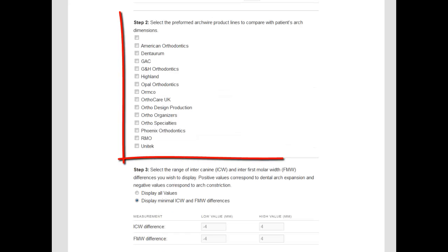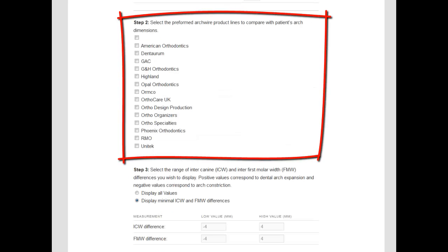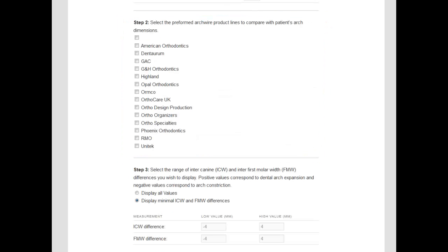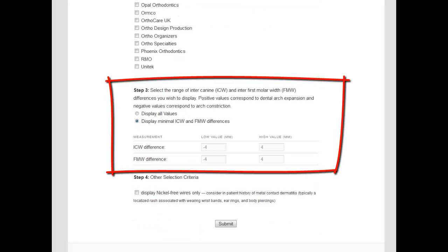The second section is for vendor selection. In the third section, users determine the range of width differences to display. The program can display values for all arch wires screened, or it can be instructed to show only those arch wires that differ from dental arch forms by a specified amount.